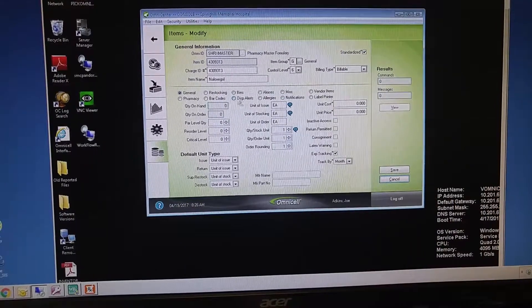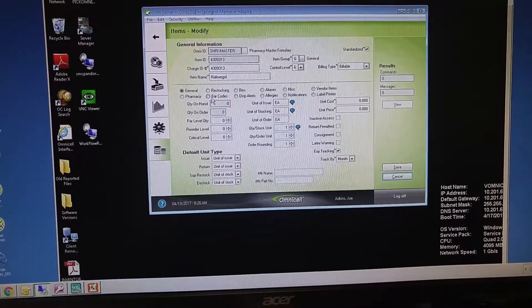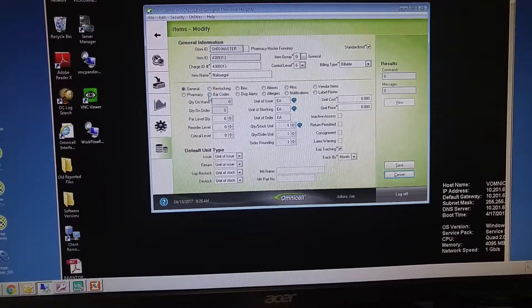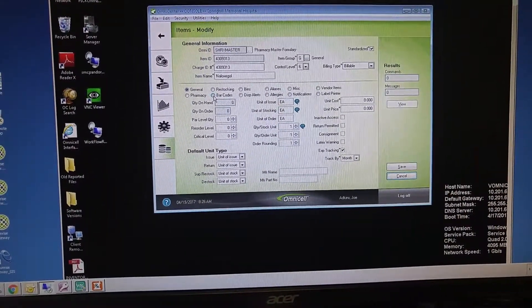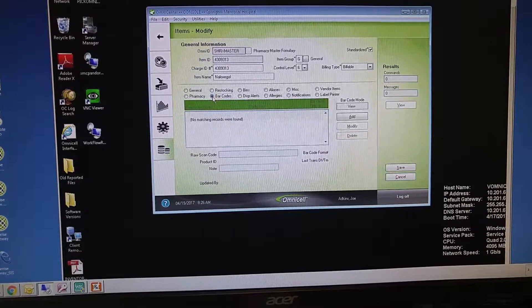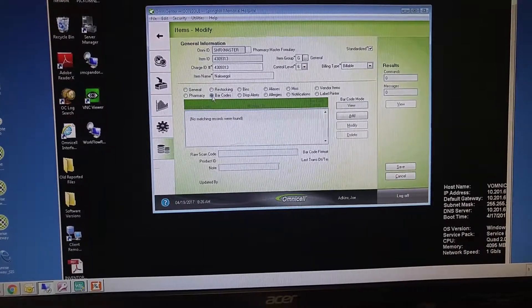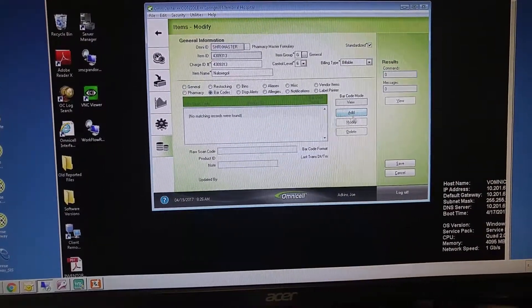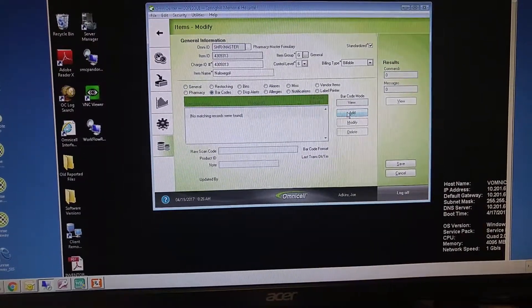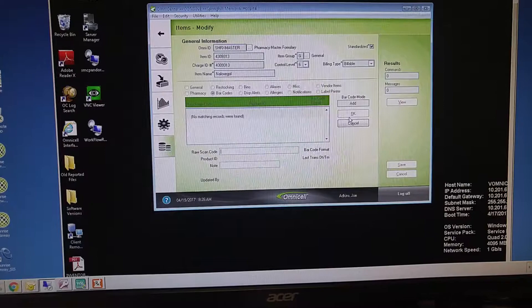Okay, within this field, you will see a button that is called Barcodes. Click on Barcodes, and we are going to add a barcode, so click that Add button.